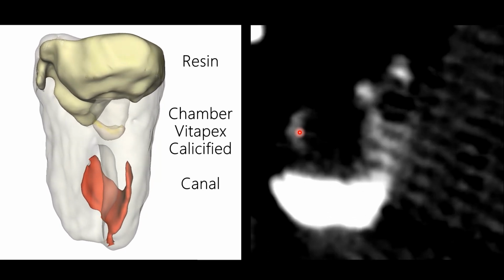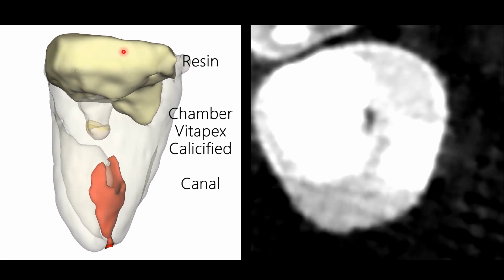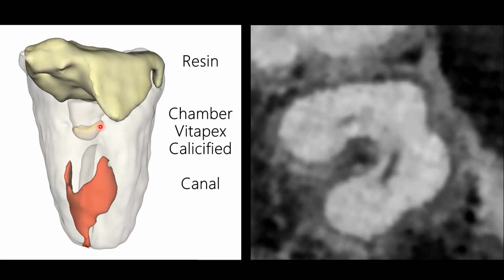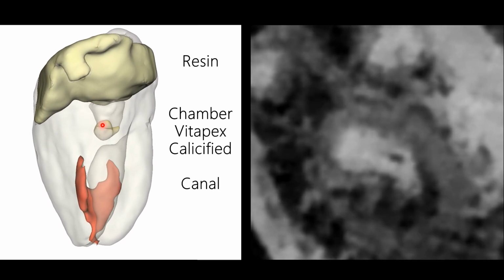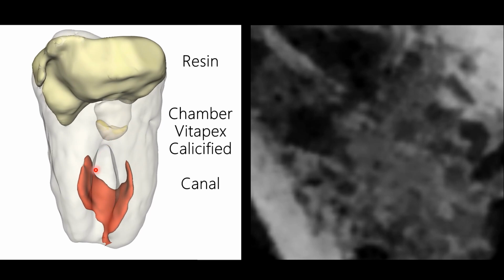And this one is the reconstruction of the CBCT image. The yellow one is the resin. After I drilled into the root canal, I could not find anything there. Because I have done a lot of endodontics, I am aware that if I keep going through, I may get a perforated tooth. So I stopped maybe 1 millimeter before perforating. I put a little bit of radiopaque material at my apex inside, and I sent the patient for a CBCT check.